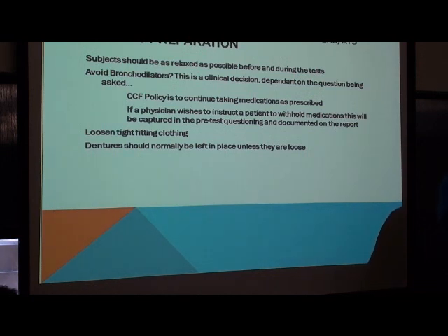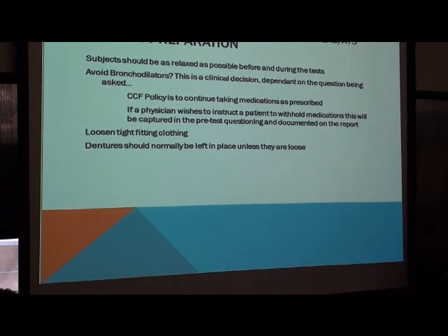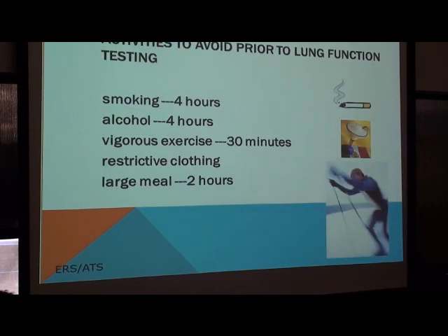And that sort of leads to the scenario that Dr. Pacherko just described. That would be one instance where definitely the doctor would want to see how they're doing without all medications. But again, that's a single patient, doctor-to-patient kind of instruction before the PFT, a special circumstance. We really wouldn't want to make withholding medication a standard for safety reasons.